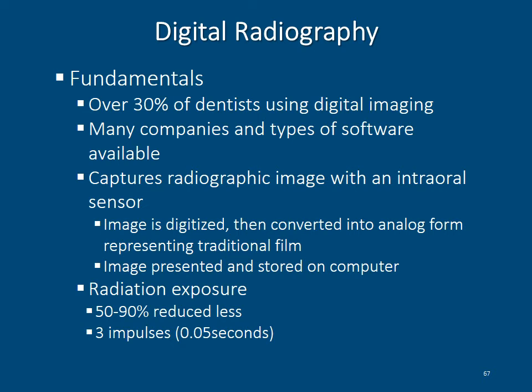I know I've mentioned it in class before that when using these digital sensors, we must use the utmost care to protect them from hitting the floor or falling and hitting the counters, because once a digital sensor is broken, it goes out for repair and can be out for the entire length of the course. This will affect all of us in that each student then will have less time on the X-ray machine to complete their requirements. So let's take very good care in protecting these digital sensors.